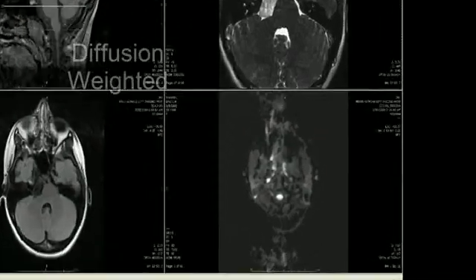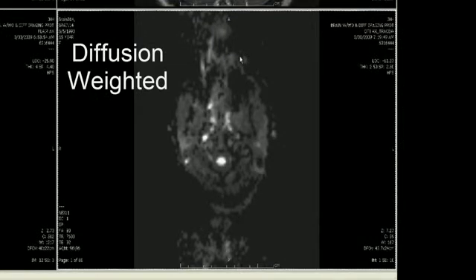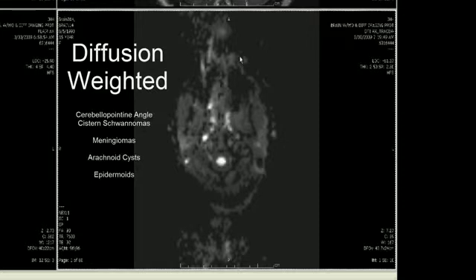The next pulse sequence to look at is our diffusion-weighted scan, because when we have an extra-axial mass, our differential diagnosis includes cerebellopontine angle cistern schwannomas, meningiomas, arachnoid cysts, and epidermoids.